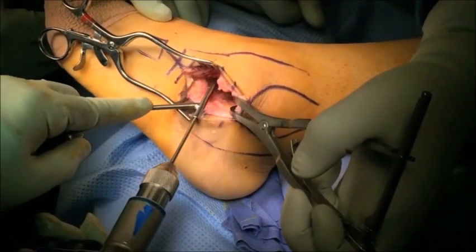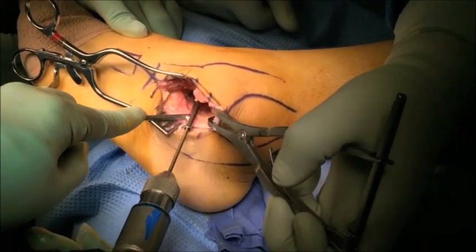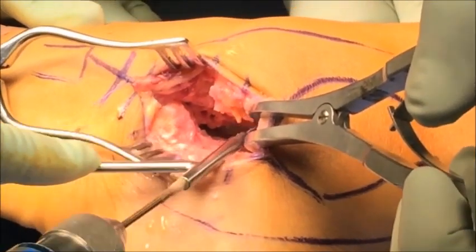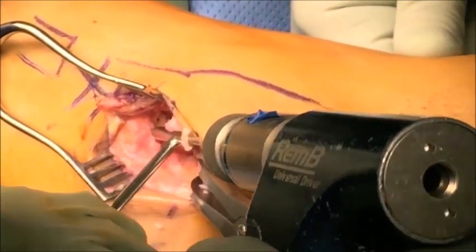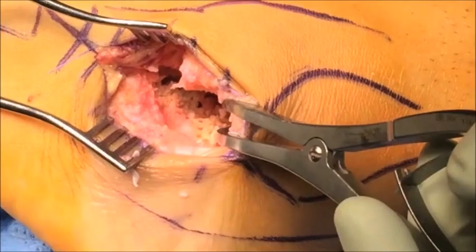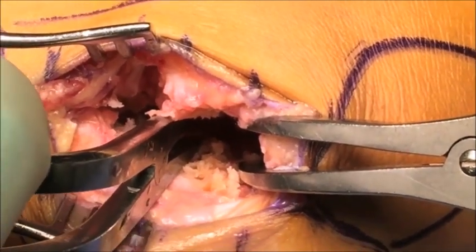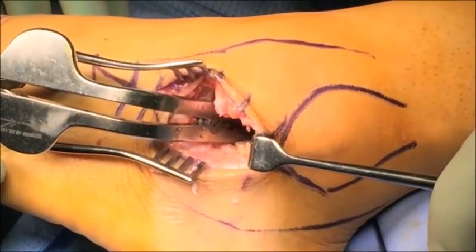A sharp 3.5 millimeter drill bit is then used to perforate the prepared joint surfaces. The reason for doing this is to form channels which allow marrow elements to access the fusion site, aiding in achieving a successful bony fusion. Make sure to drill both the calcaneal and talar sides of the joint surface. The reason for using a drill bit rather than a K-wire is that the flutes of the drill bit bring healthy cancellous bone into the fusion site. Swap the lamina spreaders around so that the posterior half of the joint can now be drilled.